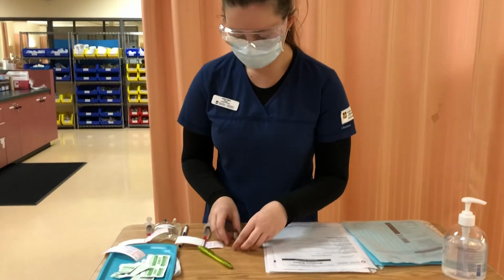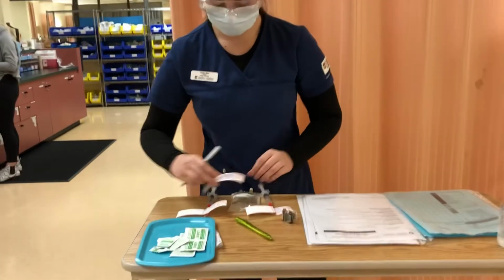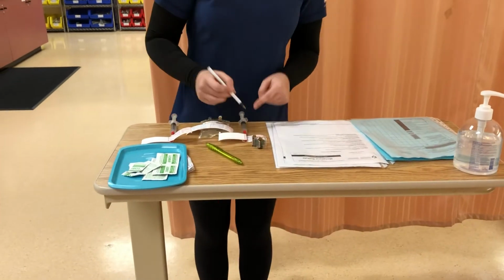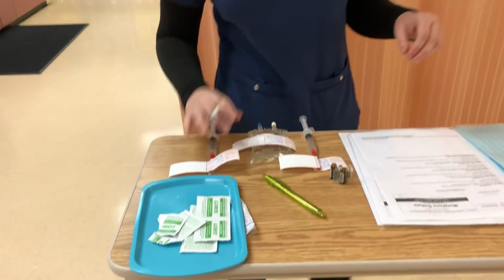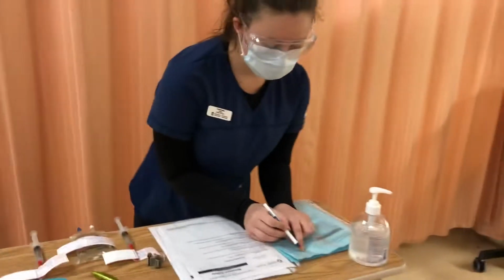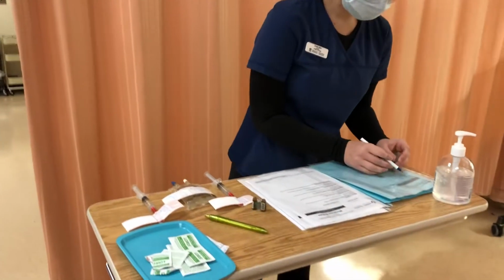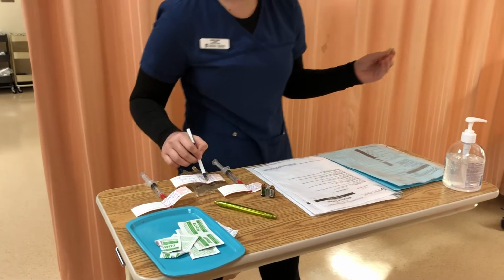And I'm going to begin my first medication check. So the check is going to be with the MAR, PDM, medication ampules, the syringe holding the medication, the mini bag, the final bag label, and the syringe with the normal saline that I'm discarding. So this is for Marcy Paris, Marcy Paris, Marcy Paris, Marcy Paris. This is morphine, morphine, morphine, morphine, and this is going to contain morphine.